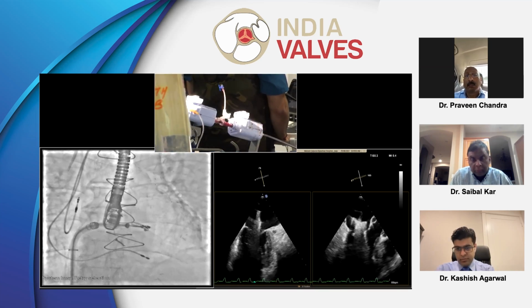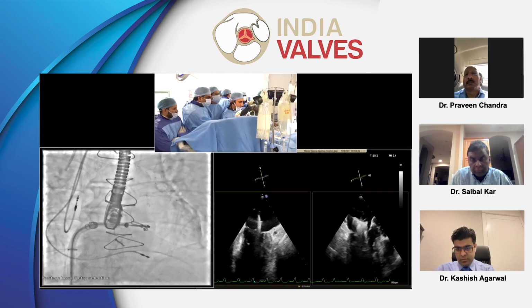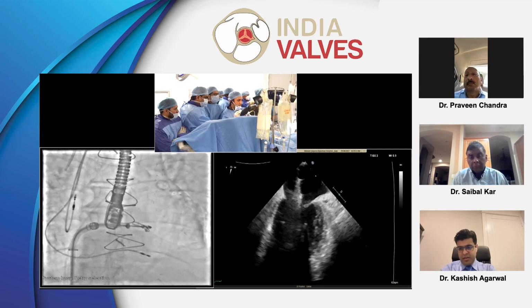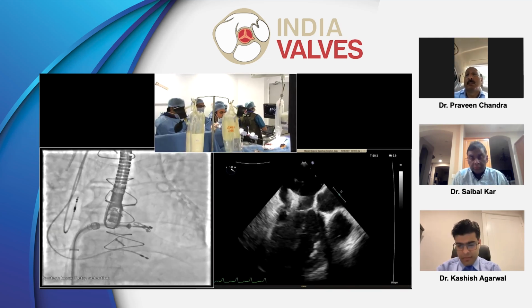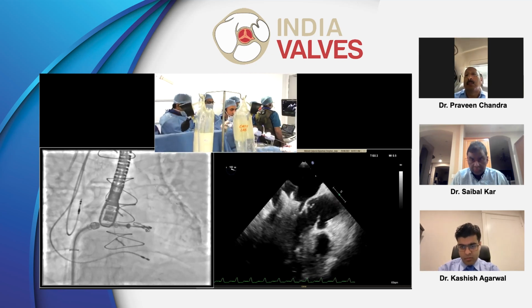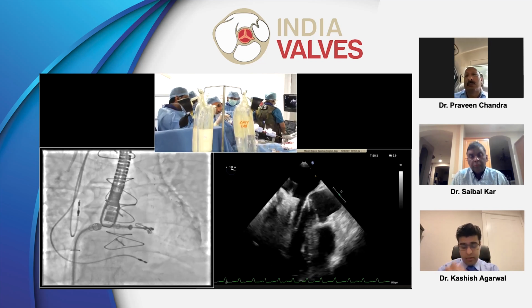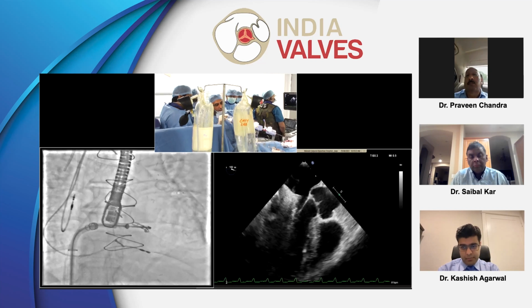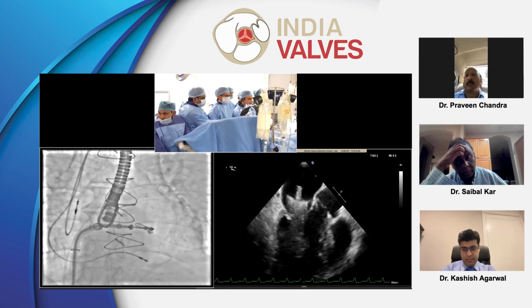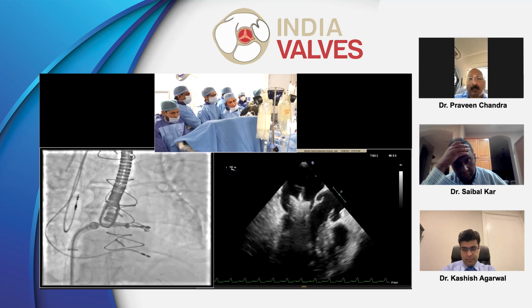And we're going to feel the tactile feedback. Okay. Prashant, go to the LVOT view. So that was anterior, the one that you had. Just go now to the LVOT view. Yeah. So that's the anterior. You can see how the gripper moves. Is that the tactile one? Yes, that's the tactile one. Okay. All right. So we have identified the anterior, posterior. Okay. So I'm going to close the clip arm a little, 60 degrees, and we're going to go.